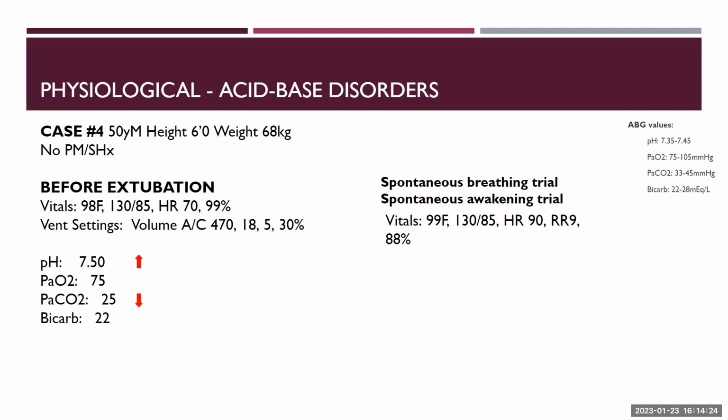So you need to lift the sedation to check what their mental status is. Right. And both for mental status, but also the spontaneous portion of your spontaneous breathing trial would not happen if the patient is not awake. If the sedation is too strong, then they're not going to breathe on their own, and it essentially defeats the purpose of trying to do an SBT.